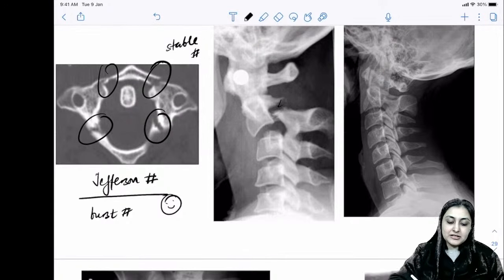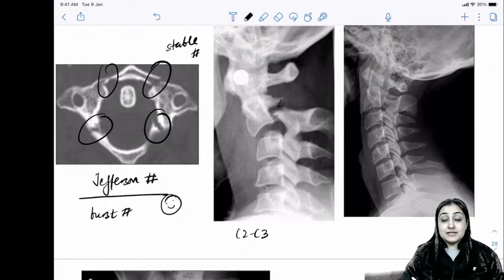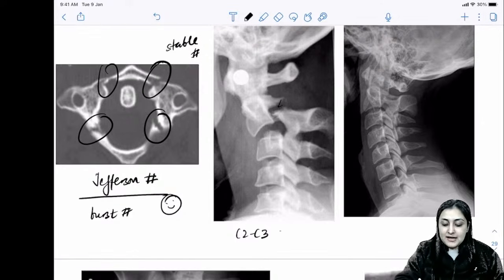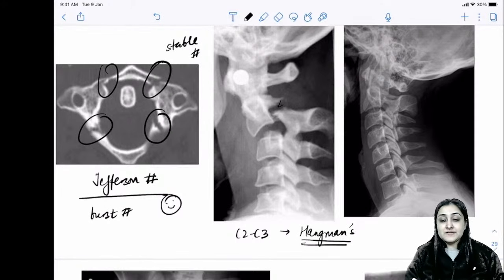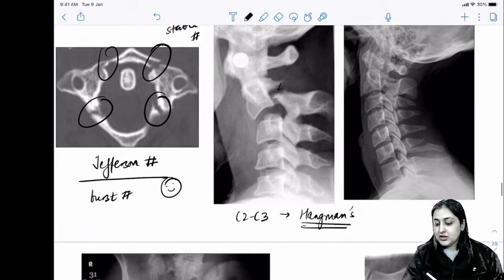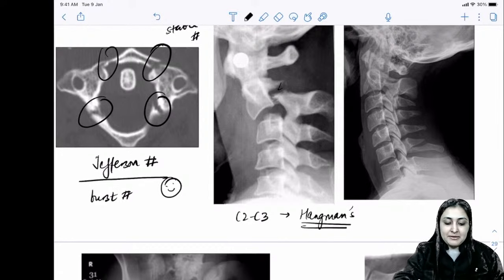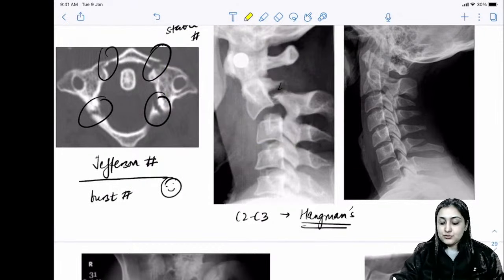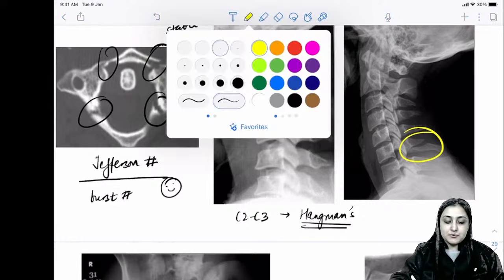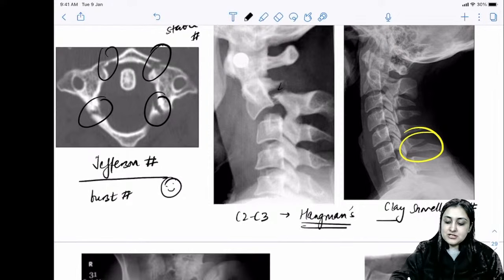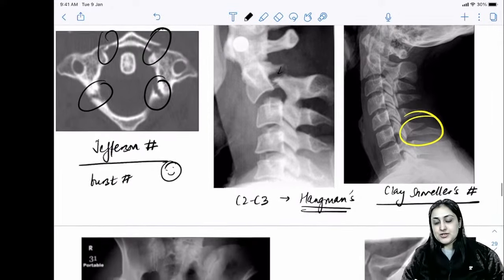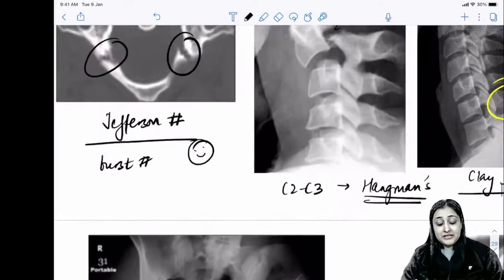Hangman's fracture is C2-C3 spondylolisthesis from extension and axial loading. Clay shoveler's fracture is an avulsion of the C7 spinous process.